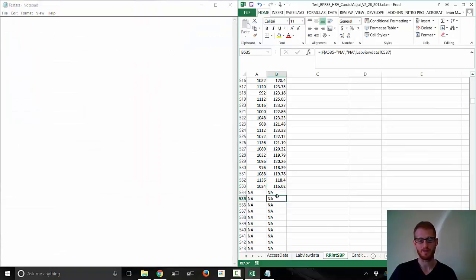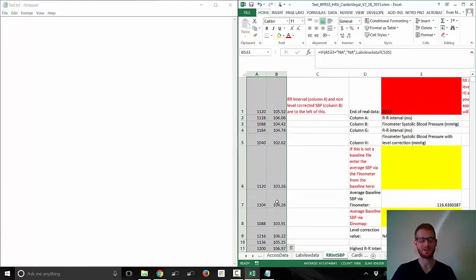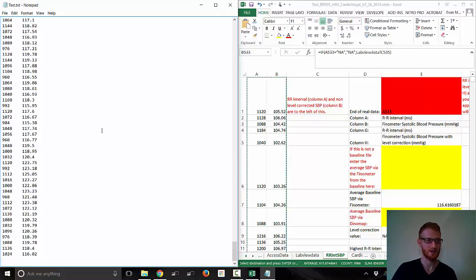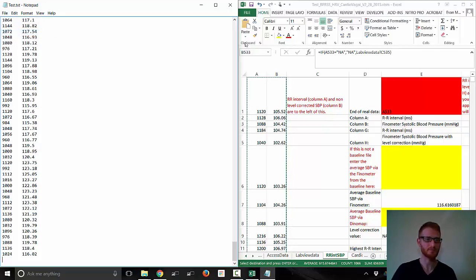We need to copy this real data to our text file. The easiest way is to highlight the bottom two cells of real data, hit Ctrl-Shift-Up to highlight everything from that point upward, then hit Ctrl-C to copy. Click over to the text file, hit Ctrl-V to paste, and now you have all the data in the text file. Save the text file and exit out of it.